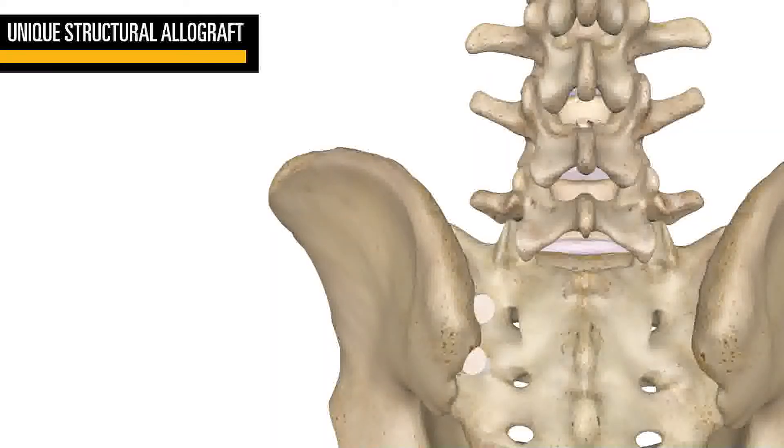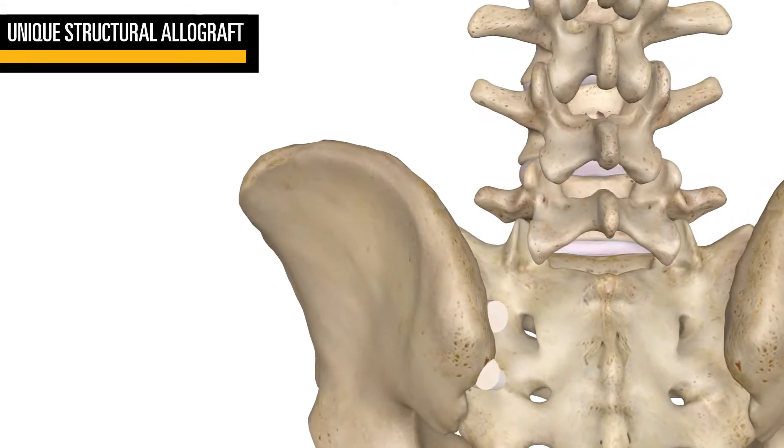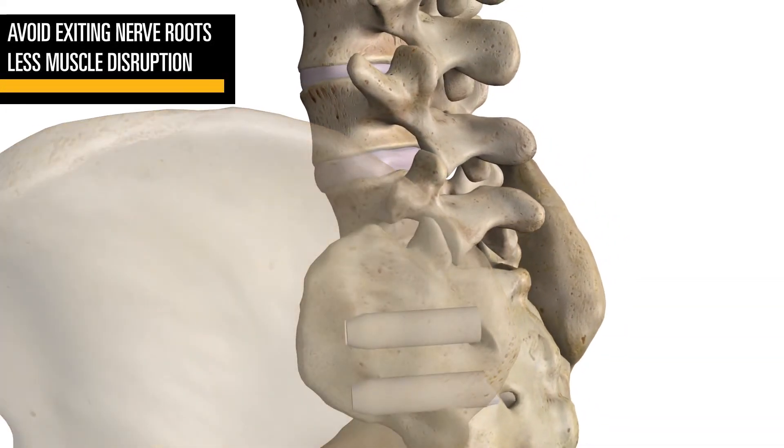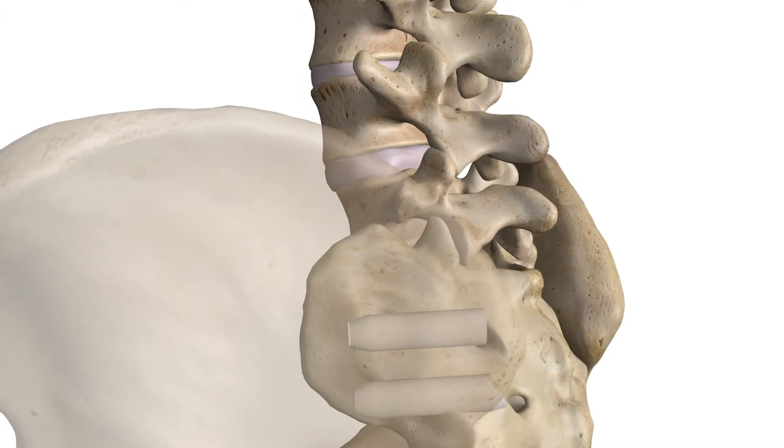The CoreLink CYBER Posterior SI Allograft System offers an effective surgical option for achieving fusion of the SI joint through direct visualization. This approach allows surgeons to avoid nerves exiting from the sacral foramina and disrupt less musculature on the lateral side of the pelvis.